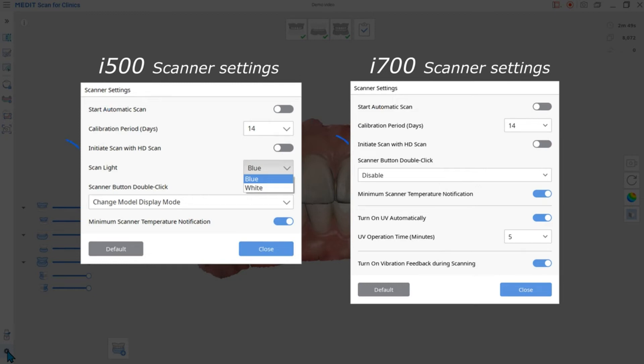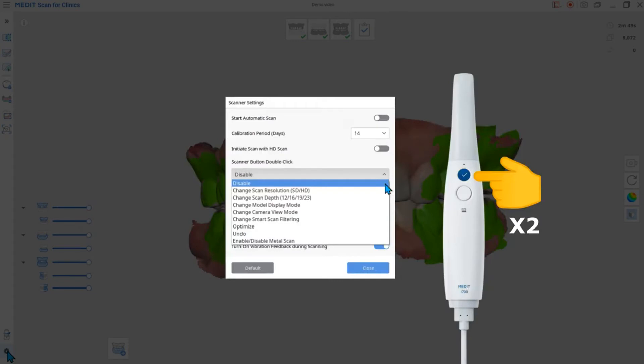The Initiate Scan with HD Scan option allows you to always start the scan in HD mode. The double-click scanner button provides a shortcut to various functions. Pick a favorite so you won't have to go back and forth between the mouse and the scanner.